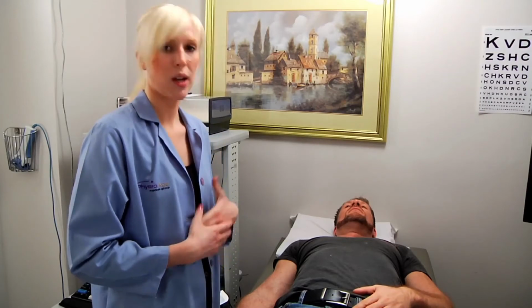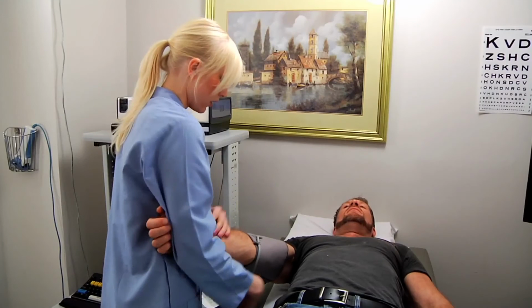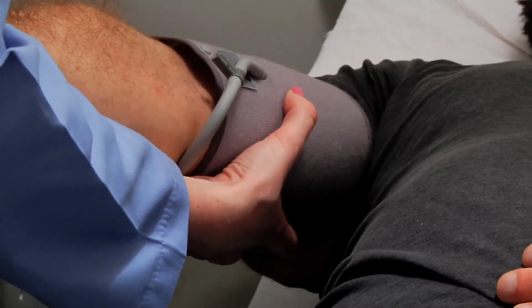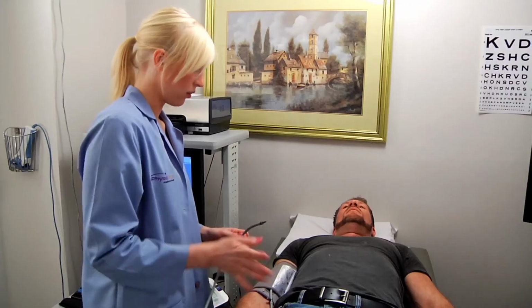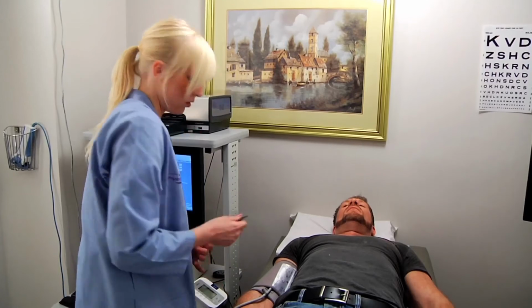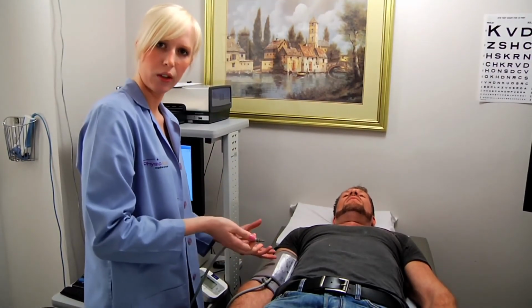So the first thing I do is I put the blood pressure cuff on them. You don't take the blood pressure right away. Make sure the arrow of the blood pressure cuff is lined up with the center of your elbow. Get it nice and tight there. Velcro it down, and I set their arm down. Plug this in. I also find it helpful when you're putting the blood pressure cuff on to remove this from the machine because you can move the cuff around a little bit easier.